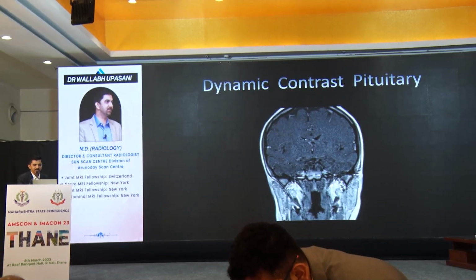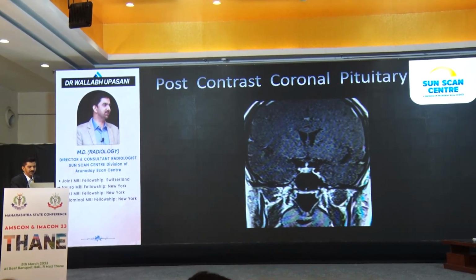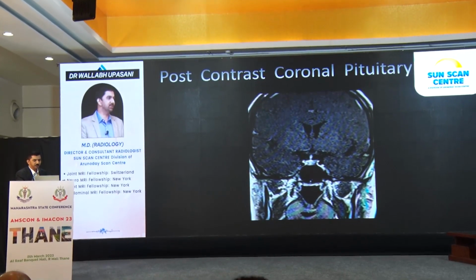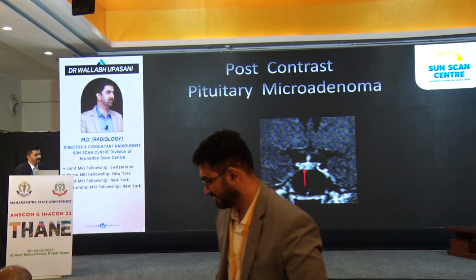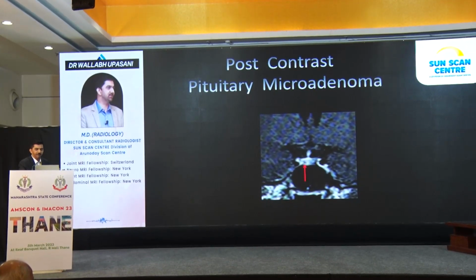Let me show you a static image. It's showing a very small pinpoint lesion here. Let's zoom in. And that's how small a pituitary microadenoma looks, almost like a pinpoint.